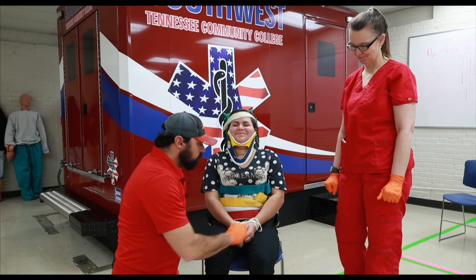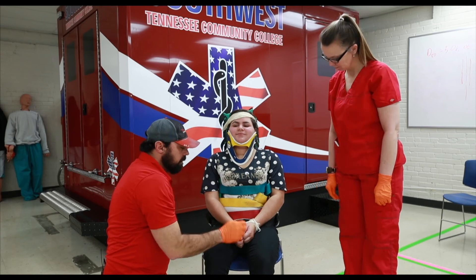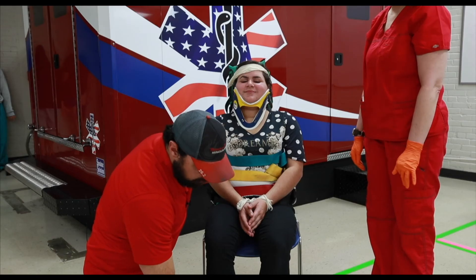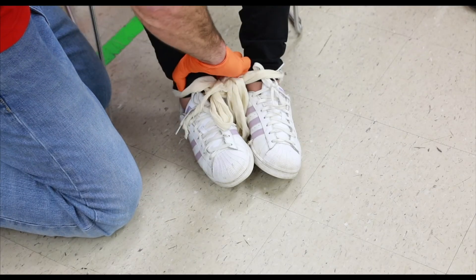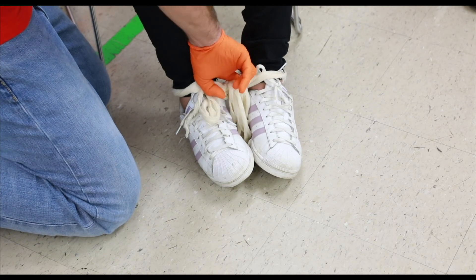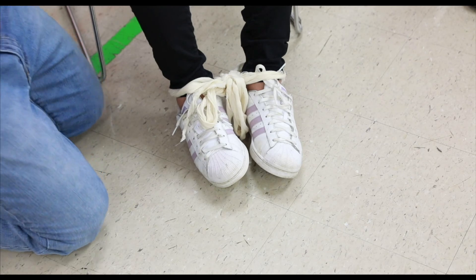Once you have this done, you're going to go back and check pulse motor sensory of all four extremities. Can you feel me touching you? Can you wiggle your fingers? Coming down to the lower extremities — you can always go behind the ankle if you can't feel through the shoe. Can you feel me touching you? Can you wiggle your feet? You've got your positive pulse motor sensory.